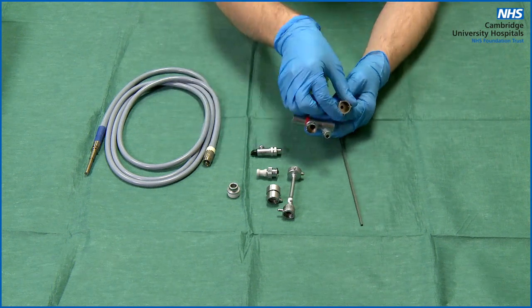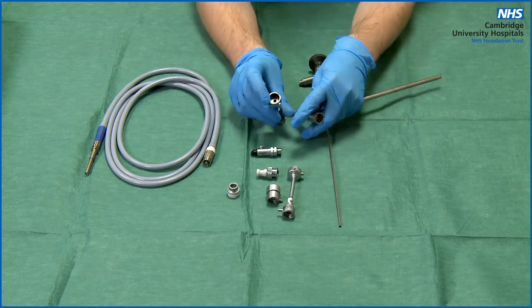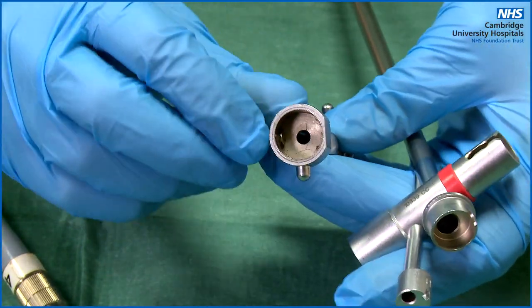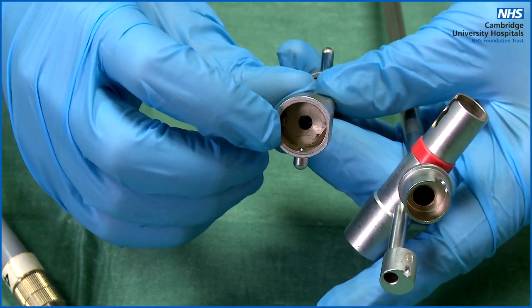To connect the bridge to the bronchoscope, you will need to locate your markers. At the top of the scope there is a small wedge missing from the ring. Simply locate the raised notch on the inside at the bottom of your bridge, line the two up, press together, and you should hear a click.